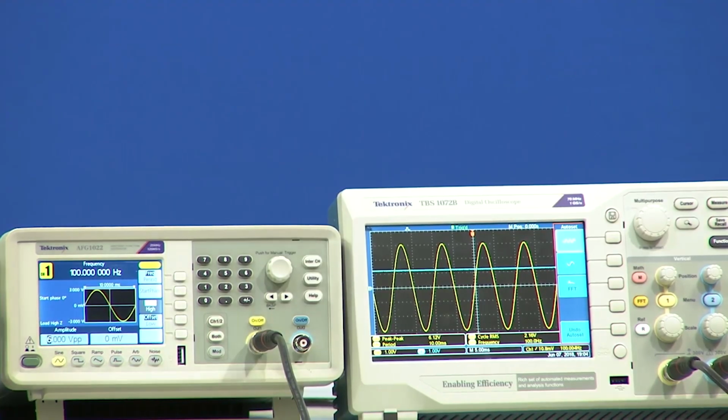Now what is the other stage that we have seen? The other stage is we have to pass through the comparator. So we have to connect the negative input of an op amp to this particular point and the positive input to the input signal, so that with that connection, we can see the output of the op amp go to the plus VCC state, right, whenever the input is greater than the threshold.